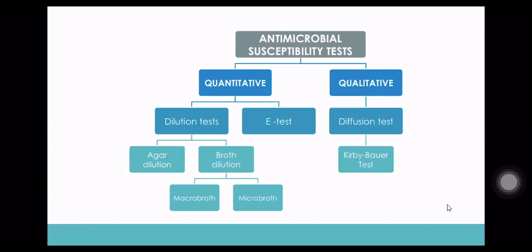And then next, qualitative naman, amo na tong SIR. We are using the diffusion test and is specifically the Kirby-Bauer disc diffusion test. Ano ganing other name? Kirby-Bauer technique or disc agar diffusion test. Amo na siya ang other name ni Kirby-Bauer, the disc agar diffusion test.